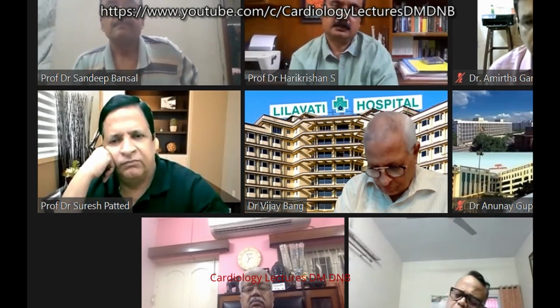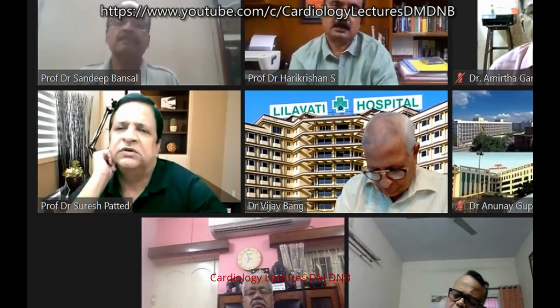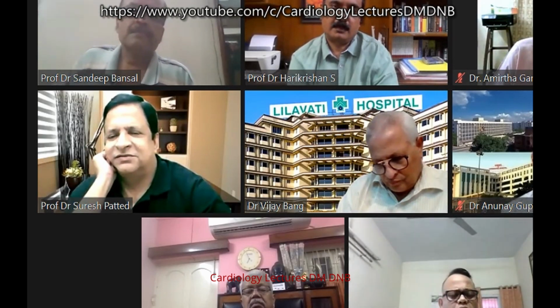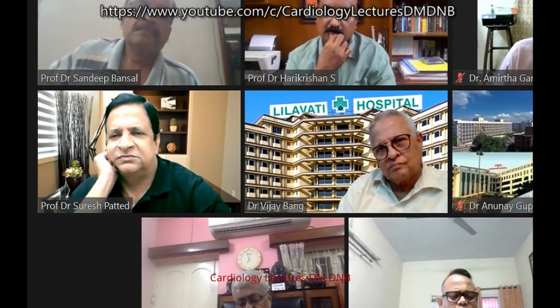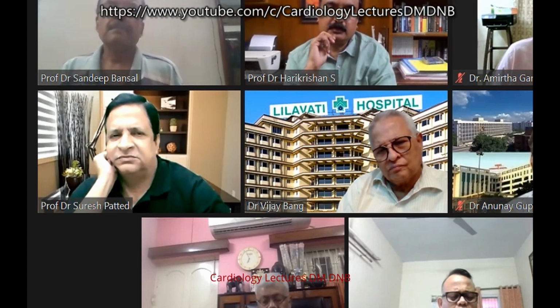So what balloon do you want to use? Tyshak balloon, ma'am. No, what size? What size, ma'am? In this patient, ma'am, 9.5 mm is sufficient. But because of RV dysfunction, we will use it in stages. We will first use a smaller balloon, then we will stage. We will complete the procedure in 2-3 stages.